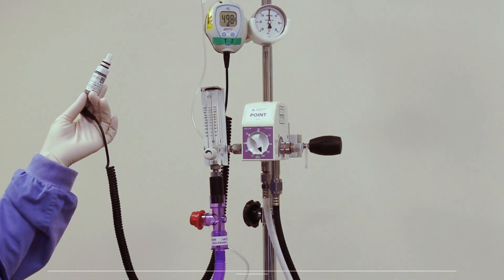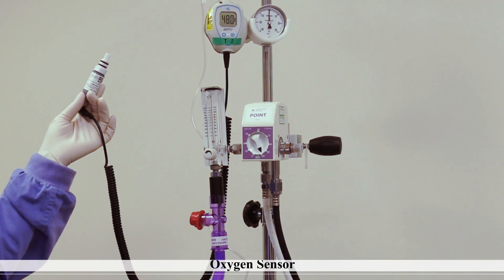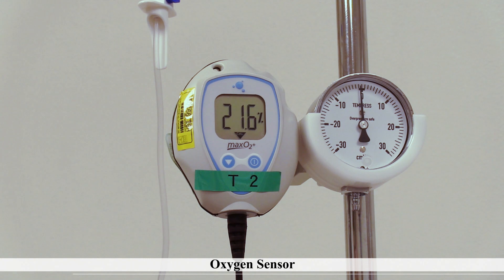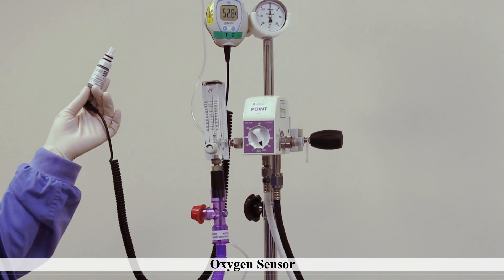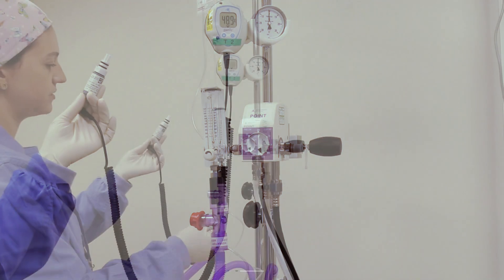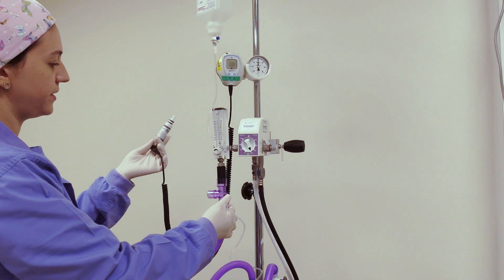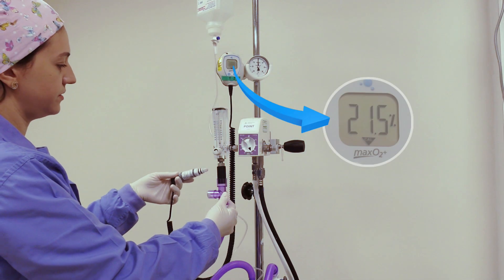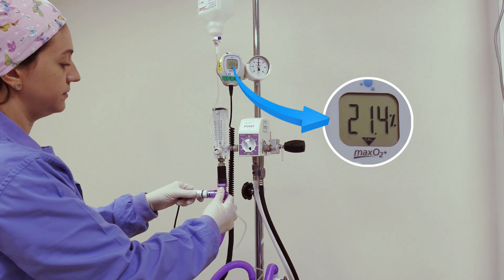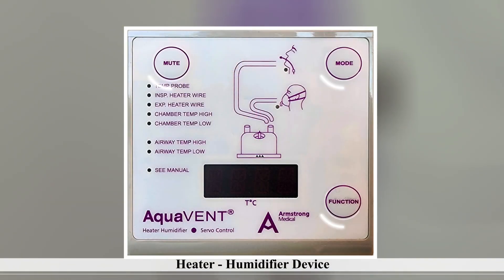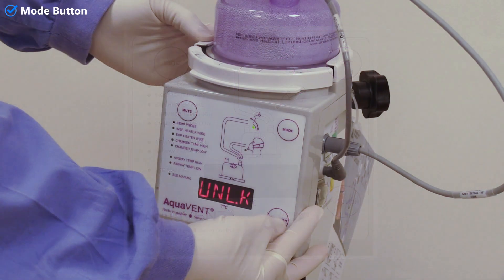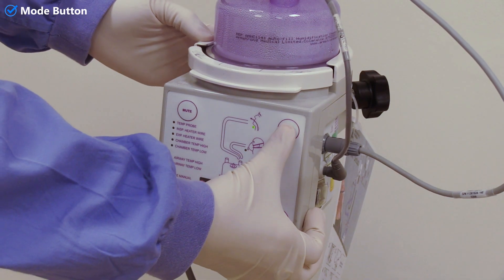This is the oxygen sensor, responsible for reading the oxygen concentration delivered to the patient. It must be calibrated by exposing it to room air before use. Once the reading reaches 21 percent, you can reinsert it.